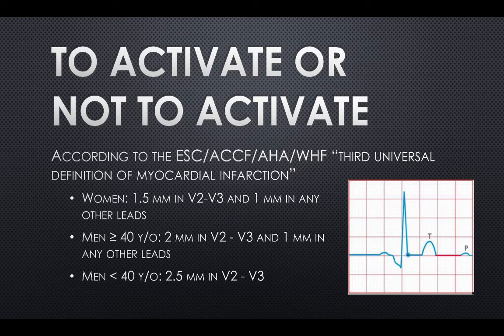So, good question. To answer that, we need to define ST elevation MI. For a technical definition, we need to refer to the Third Universal Definition of Myocardial Infarction. This was written by some very important people from these important organizations as listed. ST elevation MI, by definition, must have new ST elevations relative to the TP segment in 2 contiguous leads with reciprocal changes. But does the degree of ST elevation matter?